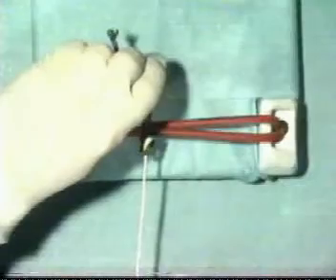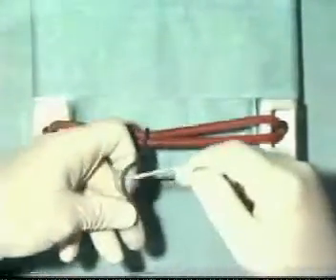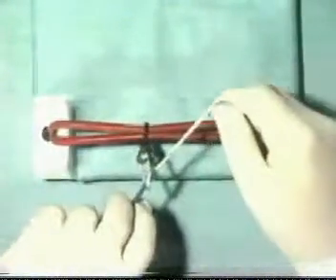A reef knot should be tied afterwards for security. It is absolutely essential that a formal reef knot is tied, otherwise the slipknot will slip and become insecure.